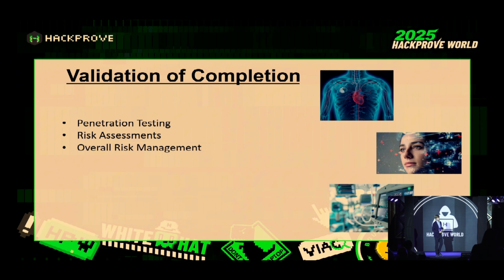They don't necessarily care about the super cool SQL injection that you managed to pull off, even though it is a very big vulnerability from the perspective of the CVSS score. It can't really hurt a patient, for example, and so the FDA doesn't care. So going through a risk assessment under the context of a medical device or a physical device, a car, whatever it is, everything is going to have its own different standards and different use cases depending on the industry.